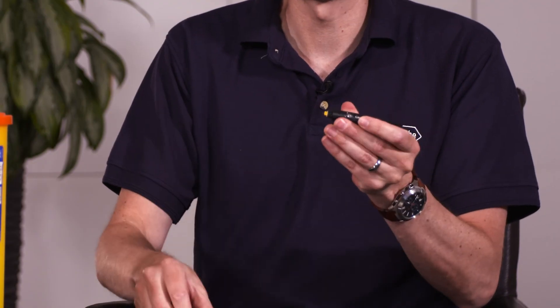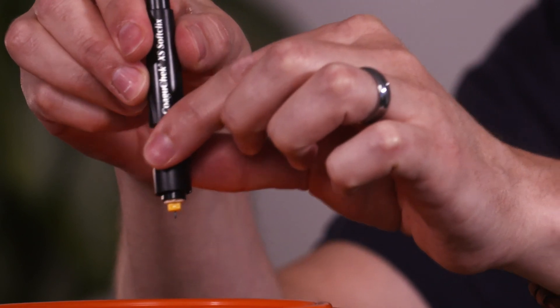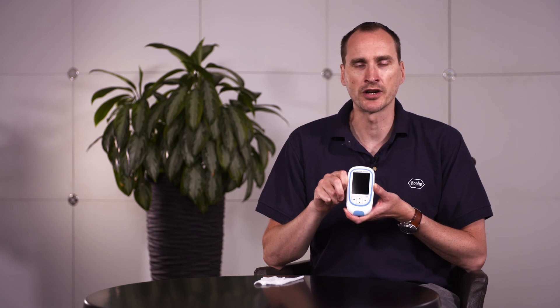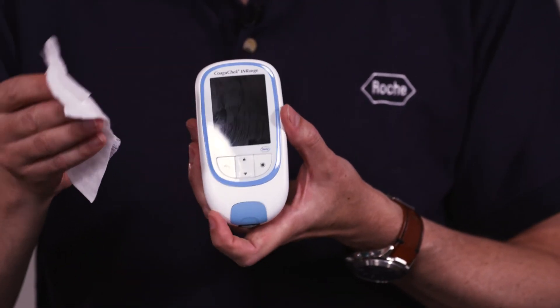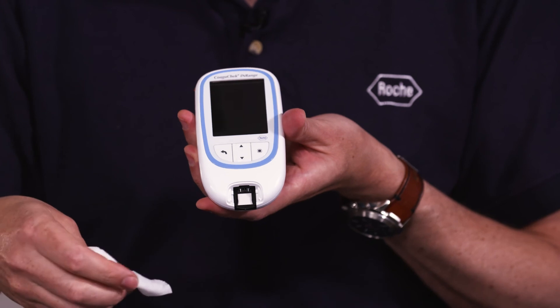To dispose of the lancet remove the cap and pull on the collar. We recommend you clean your meter thoroughly after every test. To clean the meter please follow the instructions in your manual for recommended cleaning products. The wipe needs to be lint free. Thoroughly clean the front, sides and back of the meter, and if required remove the strip guide cover and clean the pad underneath.